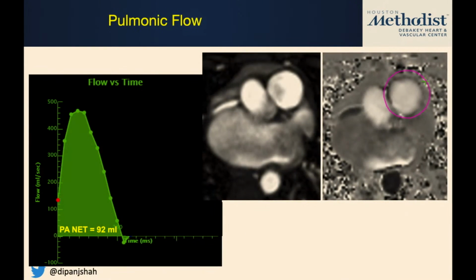Now, one of the other things you want to do, just like Nadeen talked about in echocardiography, is have multiple checks and balances in place. Although for mitral regurgitation we look at the LV stroke volume relative to the aortic forward flow, we'll also compute the pulmonary artery flow. This is an example of the phase contrast in our patient done at the pulmonary artery level, or just above the pulmonary artery. And this tells us what the flow is in the pulmonary artery.